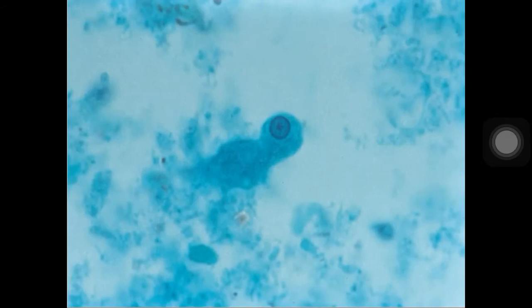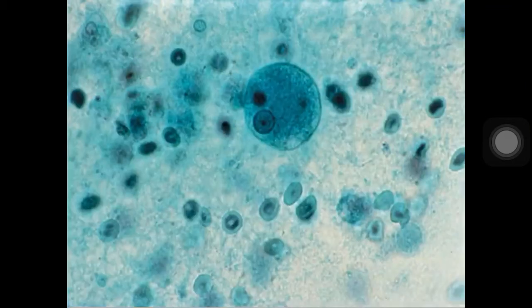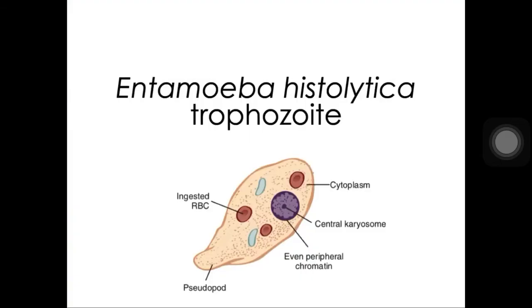this one, so we used here a trichrome stain, which is a permanent stain used for your protozoans. Second image, and for the third image, okay, nakuha po kaya? Okay, so this one is, as you know, the Entamoeba histolytica trophozoite. And again, your Entamoeba histolytica trophozoite.